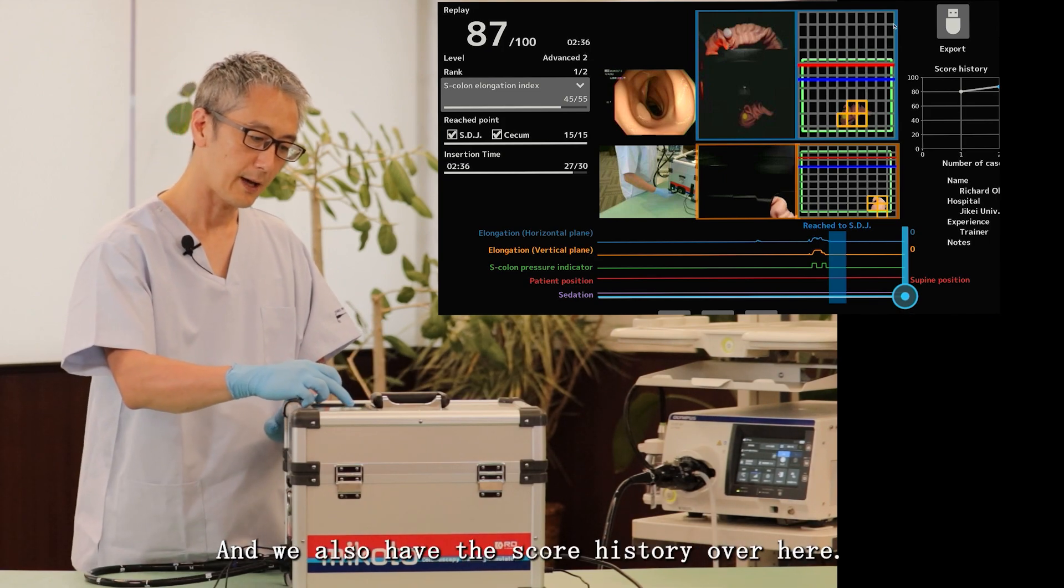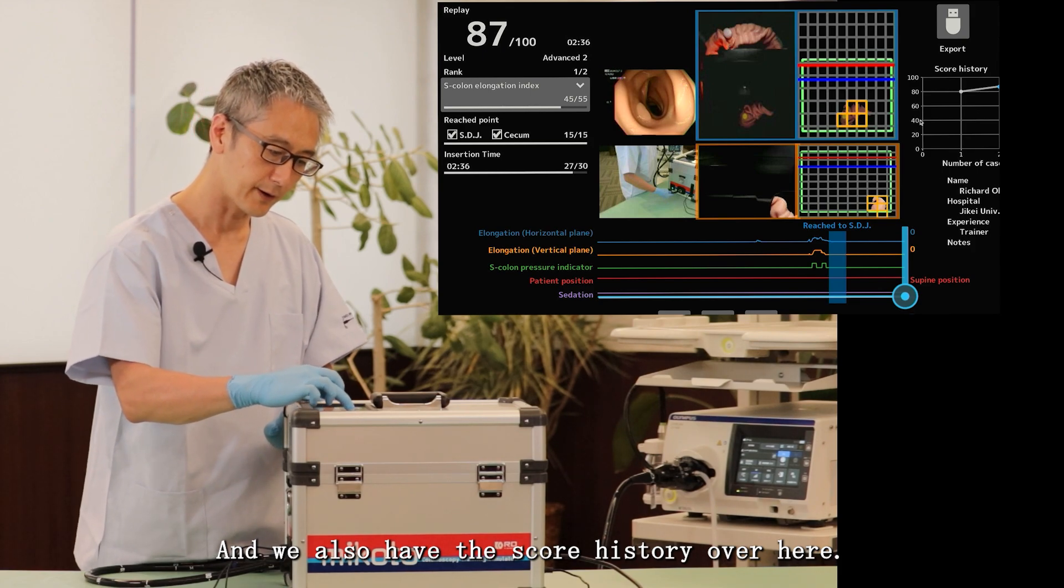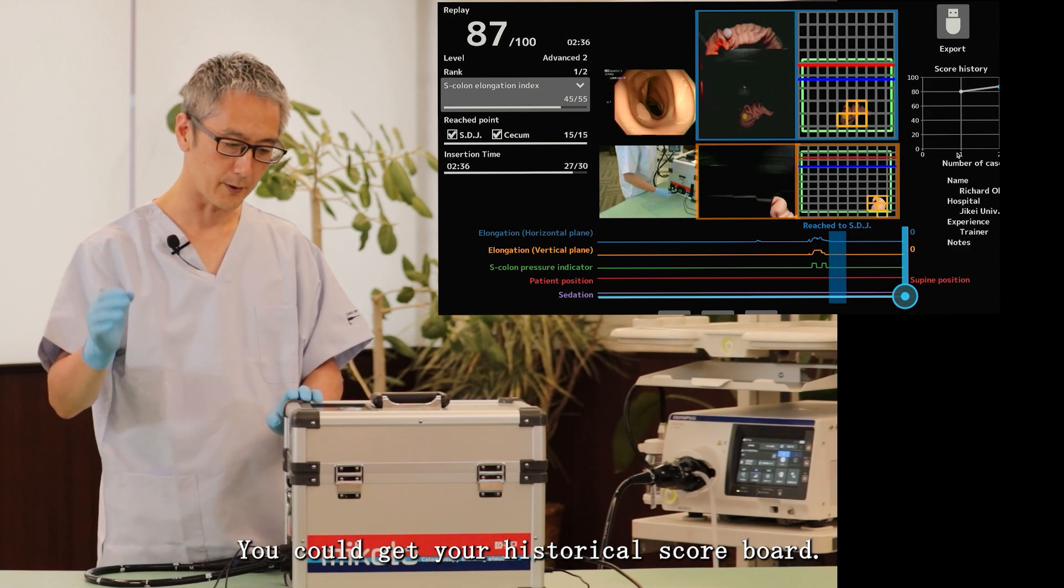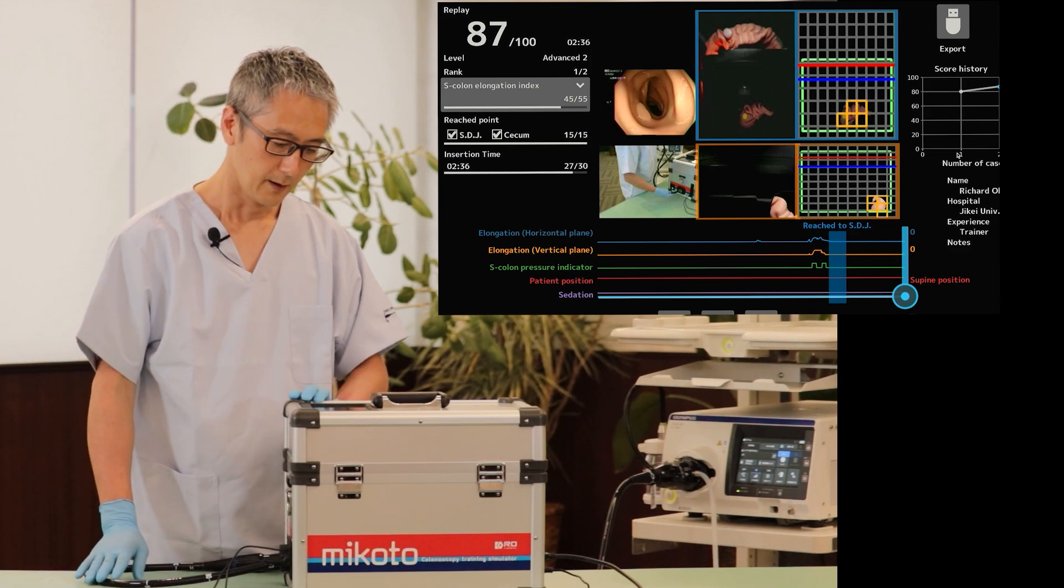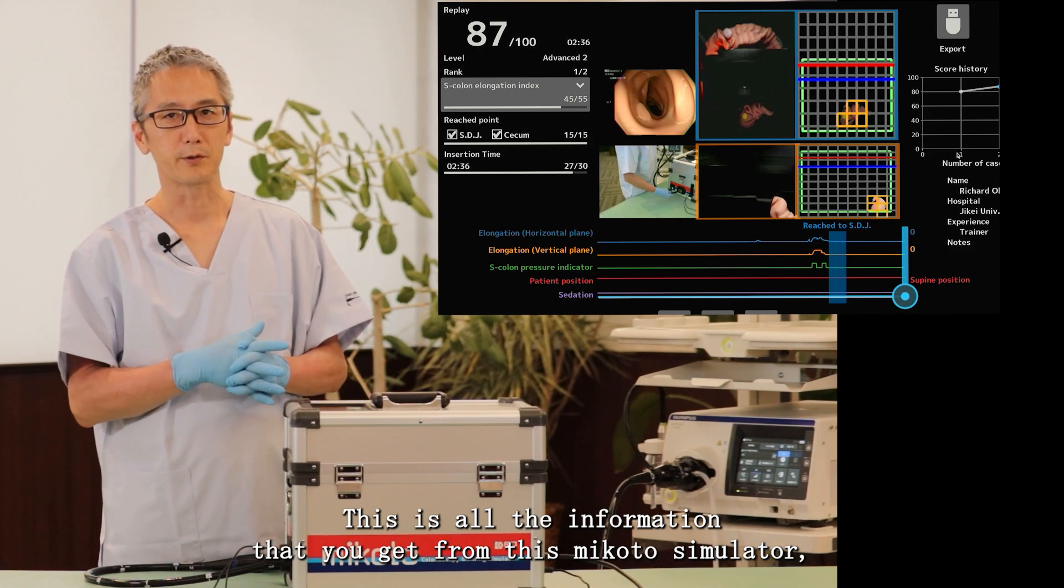And we also have the score history marked over here. As you can see, you could get your historical scoreboard. This is all the information that you get from this Mikoto simulator, which can be used for very sufficient self-training.